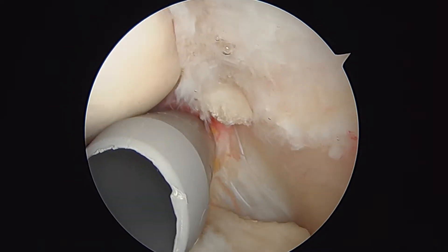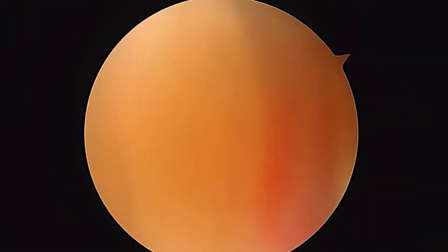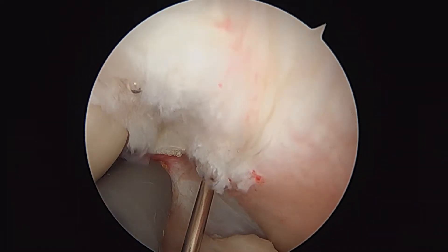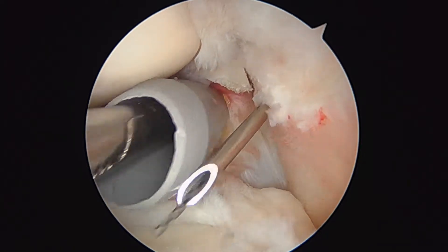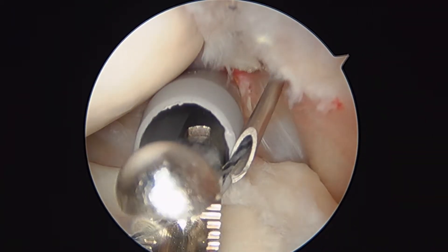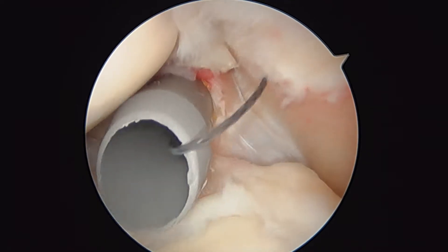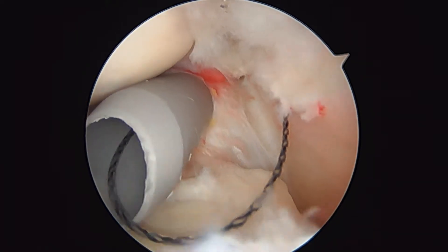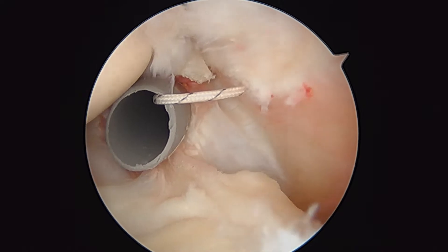Just like we did with the biceps, we're going to use a spinal needle, a shuttle relay, and a free suture. We'll take a grasper in the front. We're going to take this black wire and pass it through one more time. You can see this time we're over on the anterior side of this rotator cuff tear. We'll grab it with the grasper again, back the needle out, pull out the relay, and load the eyelet with a free suture again. Here you can see this black and white suture going on the anterior side of the tear.